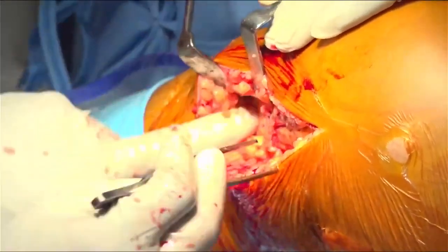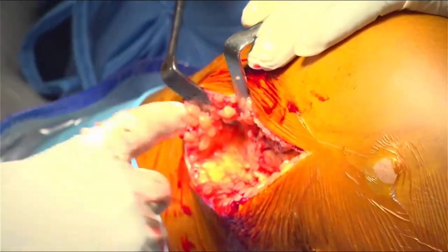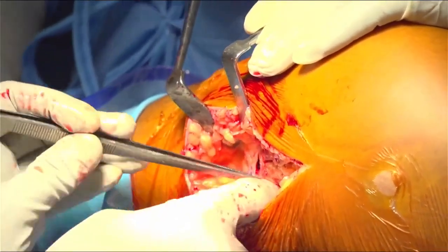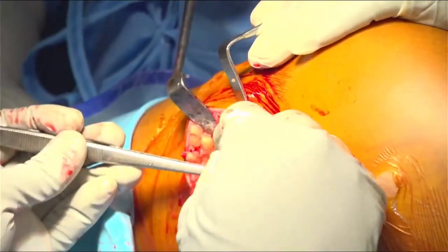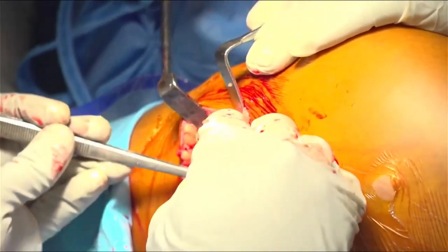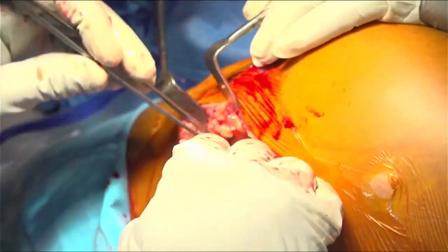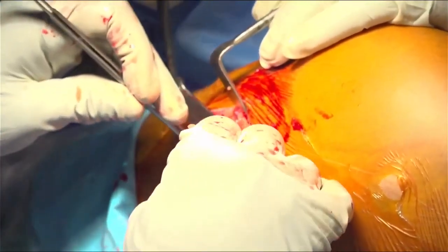Knife please. 15 number knife blade please. So I'll just harvest the. So this is my tendons.